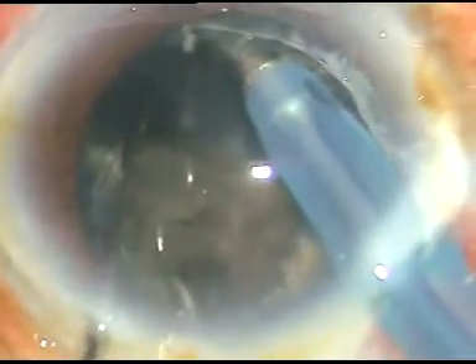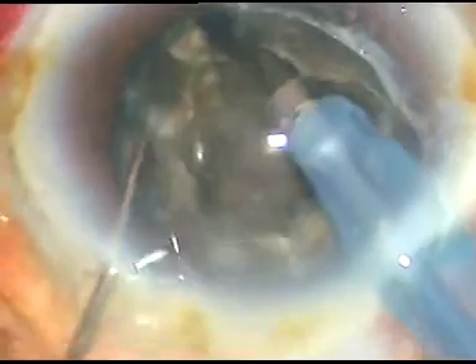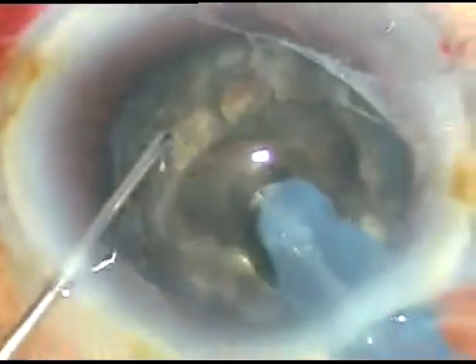Flow rate is 45 ml per minute and vacuum is 450 mmHg. I have been able to chop this nucleus. I rotate it 180 degrees, go to the other side, and try to separate the nucleus into two halves — and it separates.